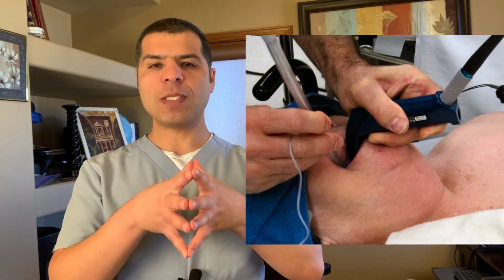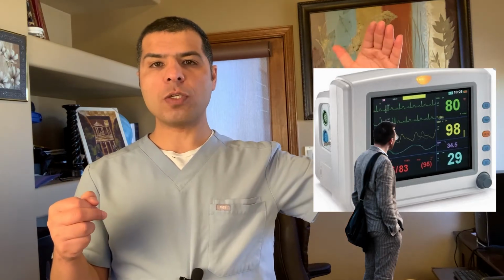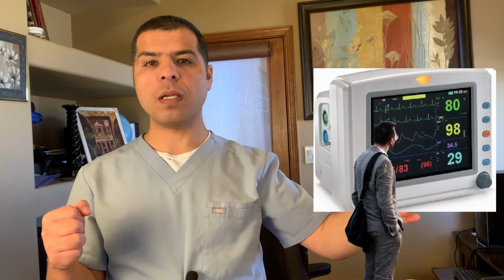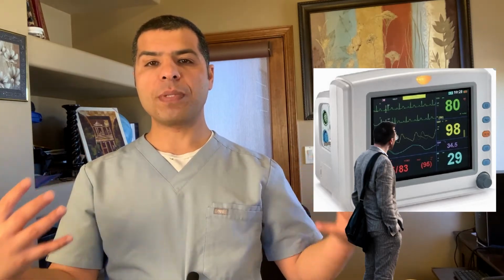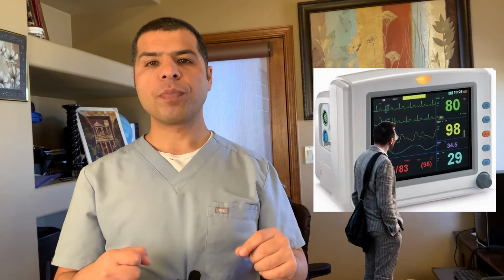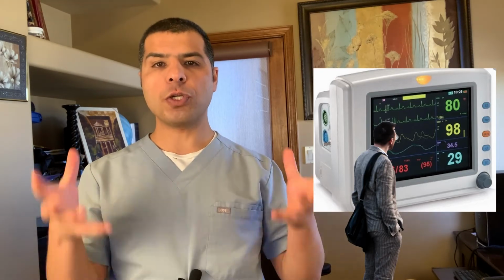Now we push paralytics, then we need to insert the ET tube as soon as possible. Again, I remind them, please update me if the oxygen saturation drops. Now, remember, this is relative. If the pre-intubation oxygen was 100%, I tell them if it drops below 90%, please update me. And if the best was 80%, I tell them, hey, if it drops below 70%, please update me. I usually give it 10%, right? If the oxygen saturation drops, you need to terminate the procedure and start bagging the patient, trying to bring the oxygen up.